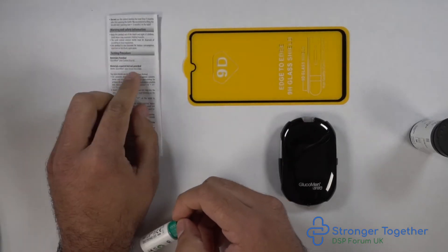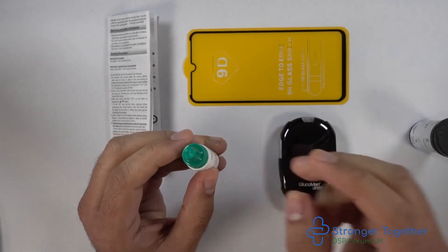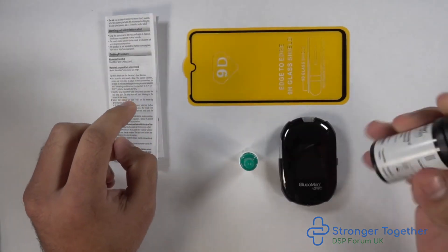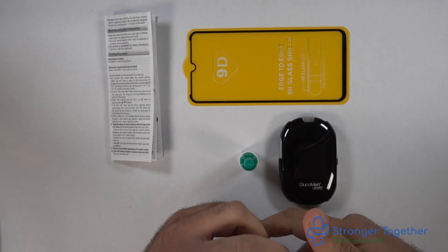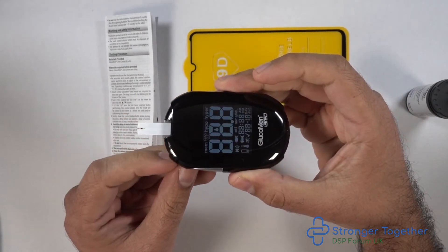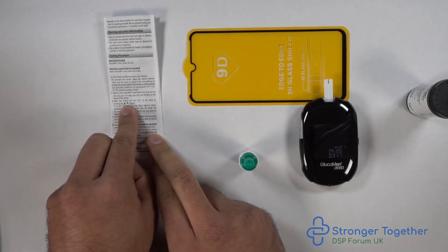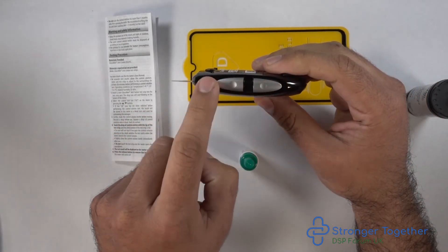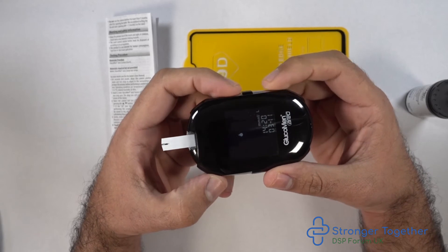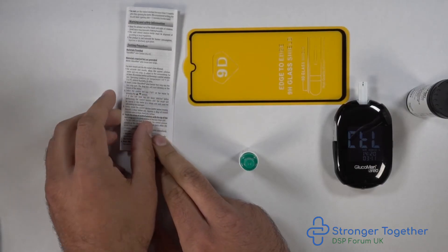Now let's get into the testing procedure. Check which solution you have — in this case we have the N solution, and the test strip pot confirms control solution N should give a reading between 5.6 and 7 millimoles per liter. The first step is to insert the glucose test strip into the top of the meter. Then on the right-hand side of the meter, press the up and down buttons simultaneously. The letters CTL will appear on the screen, indicating we are ready for a control test.